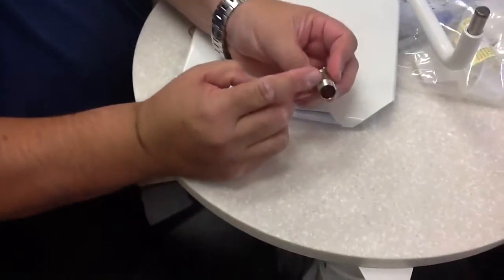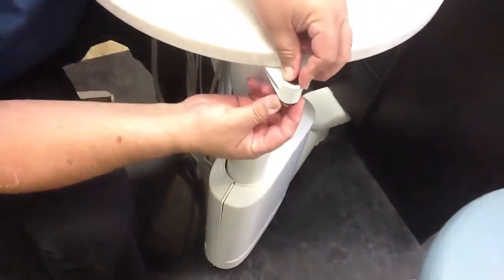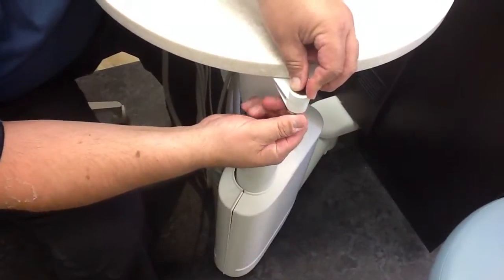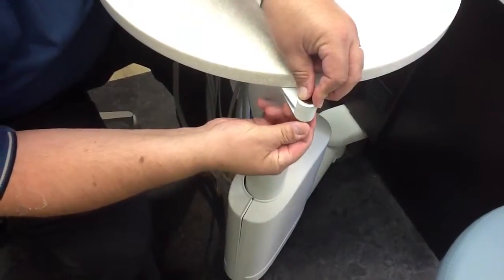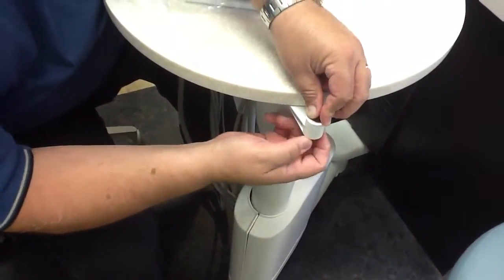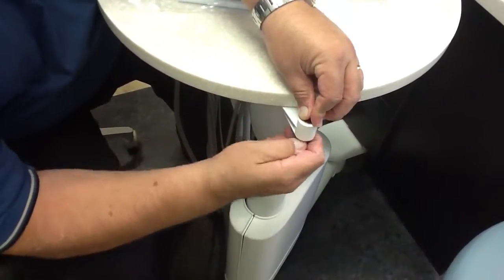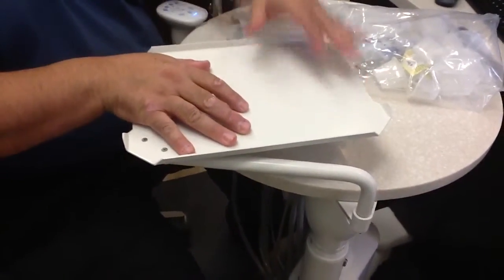This is a nut which, again, I would highly recommend that you take some blue Loctite and put it on the threading here. That way you place it through here and you tighten it down with the blue Loctite on it, and that'll give you a nice long-lasting seal and keep this whole structure nice and tight when in use, whether with a tub, a tray, or a keyboard. Okay, great.